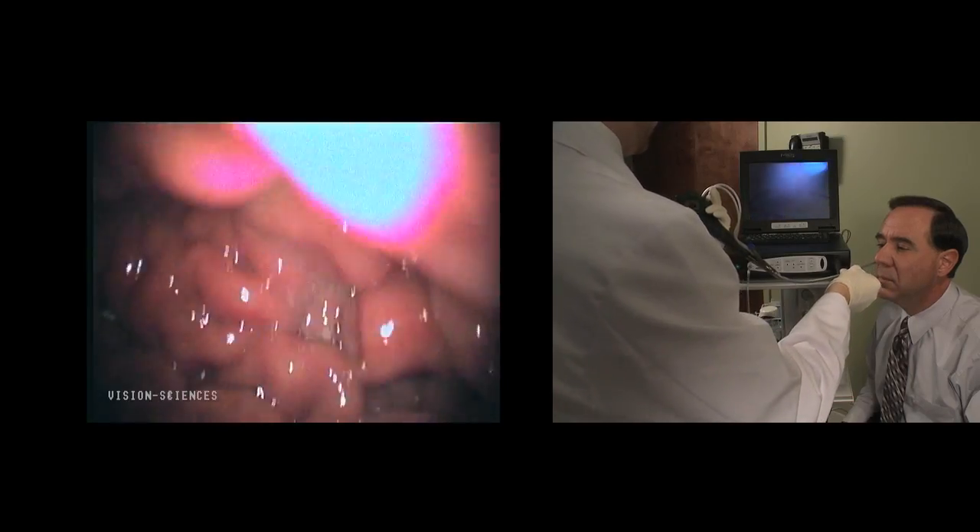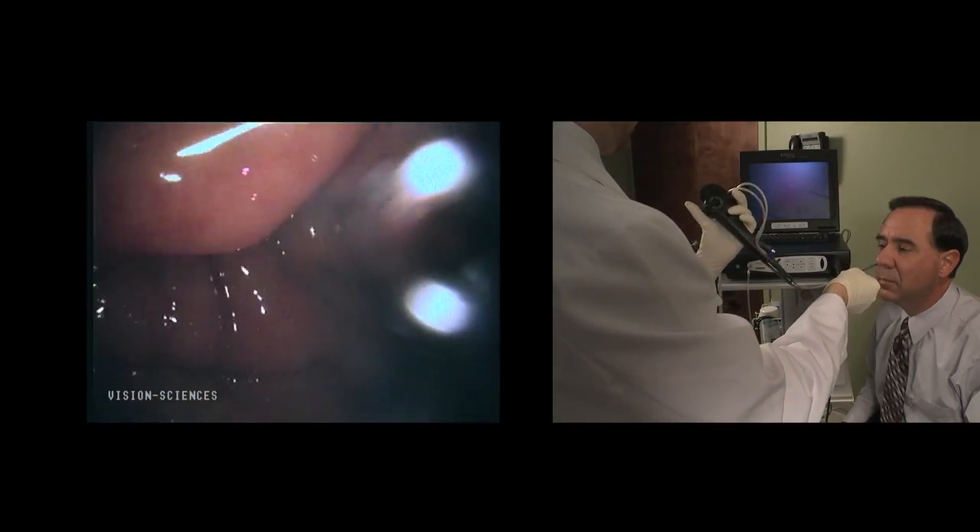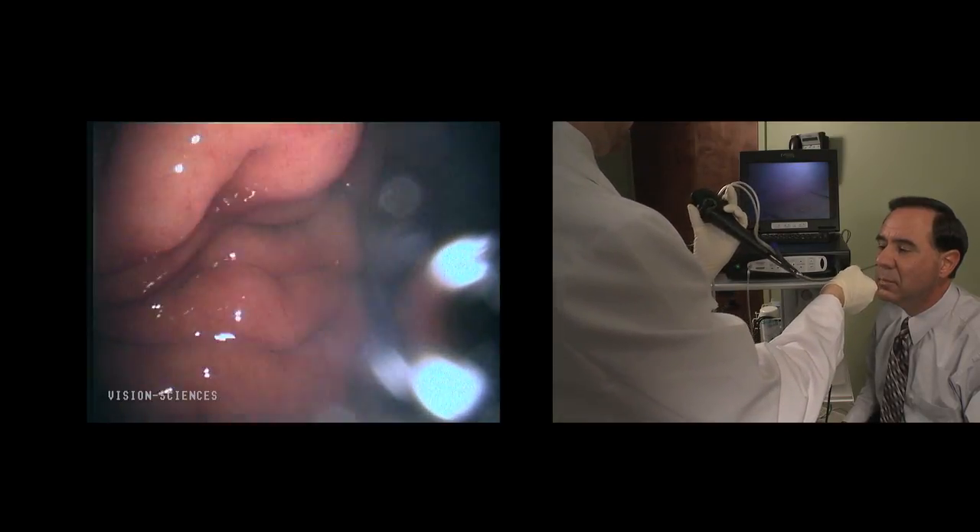To advance the endoscope through the GE junction, have the patient swallow and follow the peristaltic opening. The endoscope can be advanced to view the cardia portion of the stomach. Use the down deflection to view a retroflexed view of the GE junction.